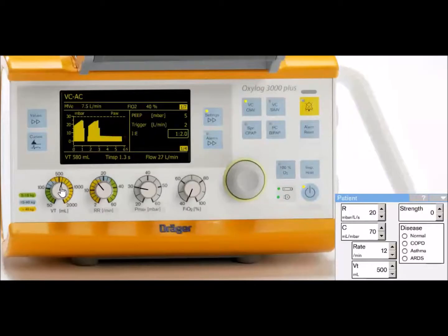And as for automatic adjustment of these parameters, so here's my measured value. Tidal volume is 600, and currently my respiratory rate is, we'll put it at 12. And I'm going to change my patient's lung compliance by changing the patient status down here to ARDS. So that's going to drop my compliance and changed it to 30. And you notice right away we already have a high pressure alarm.